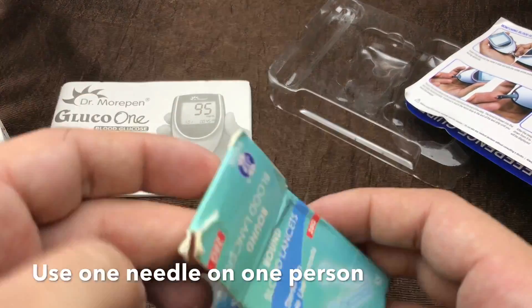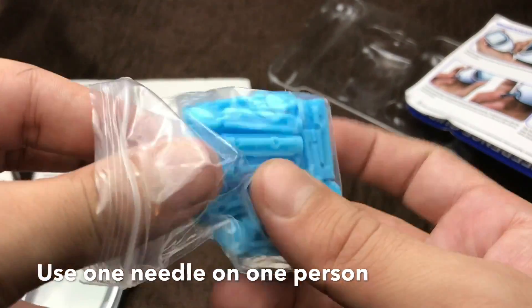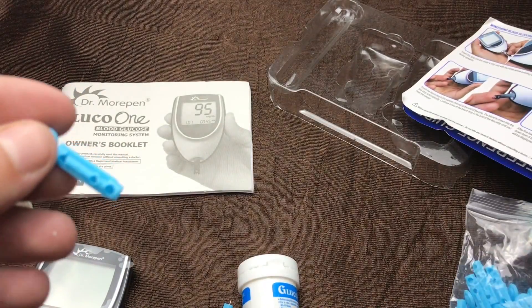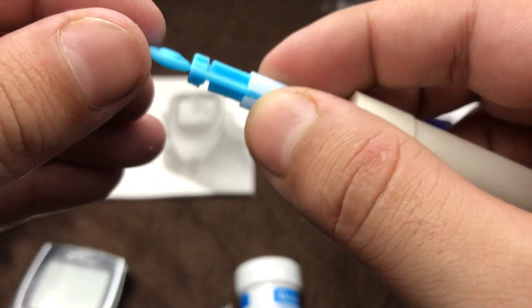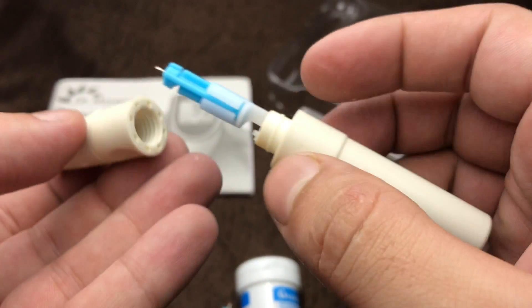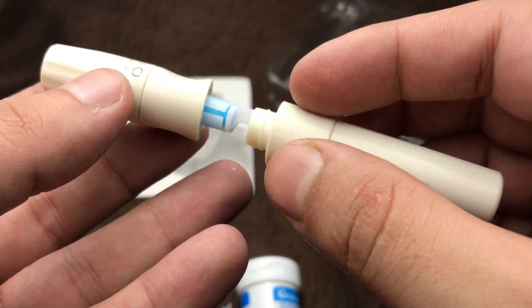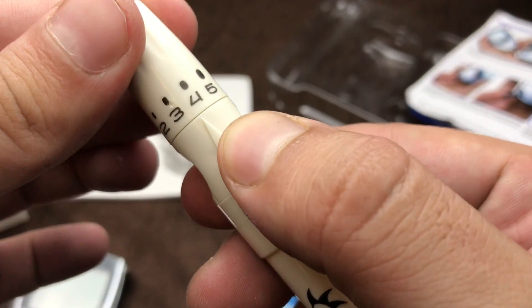These are the needles — you have to change it every time you want to use it. You can also adjust the levels as well.